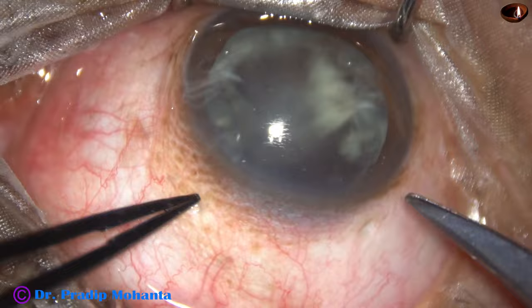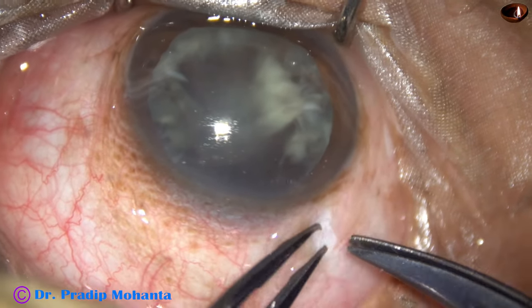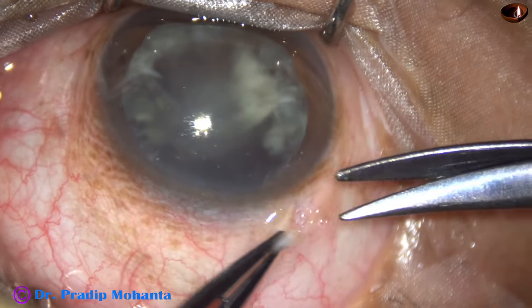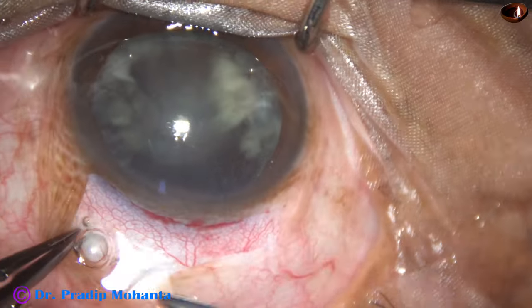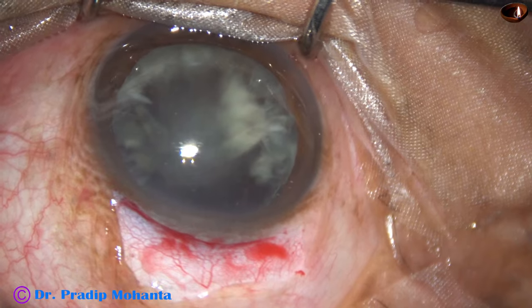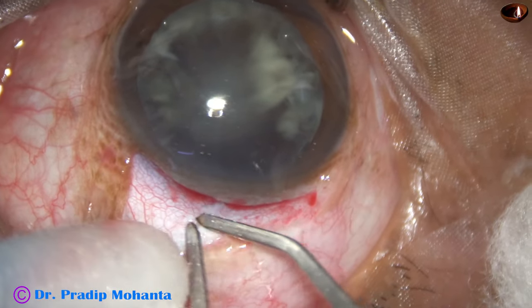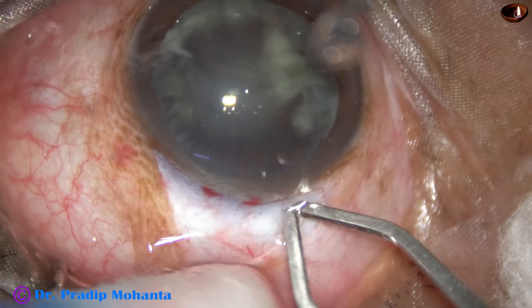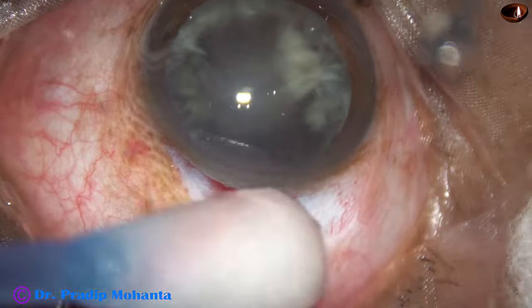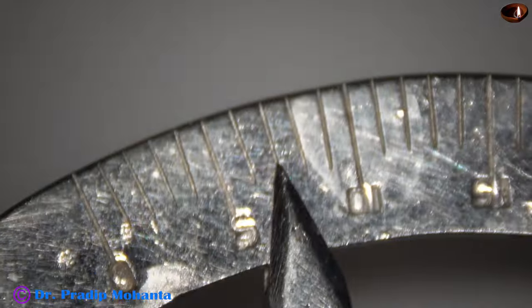How much incision we need depends on the hardness of the nucleus. In this case, a seven millimeter incision is more than enough because the nucleus is soft. This is peritomy for about two and a half clock hours. And now mild cautery is done. Care is taken not to touch the edges of the conjunctiva. Very mild cautery so that the tissue is not contracted. The scleral surface does not get charred. Now this is seven millimeter measurement.